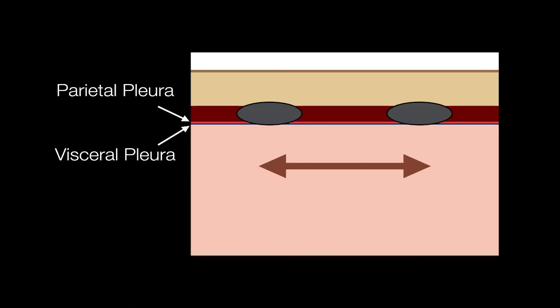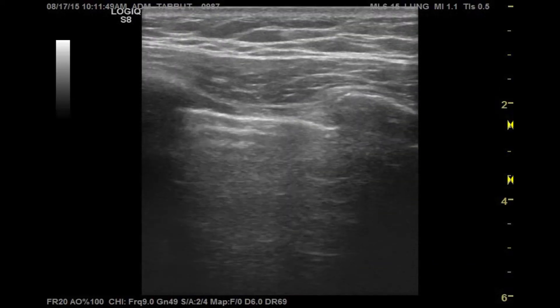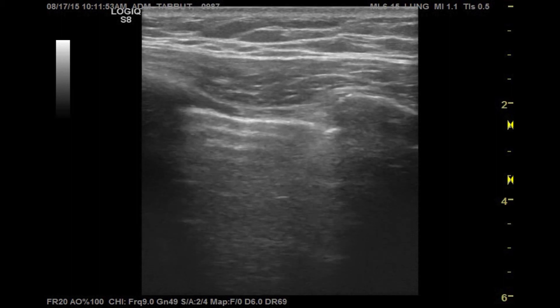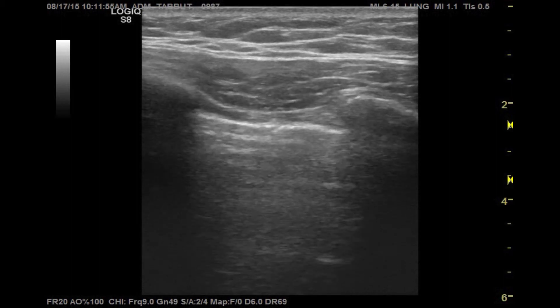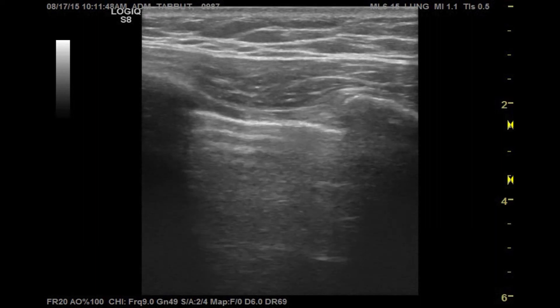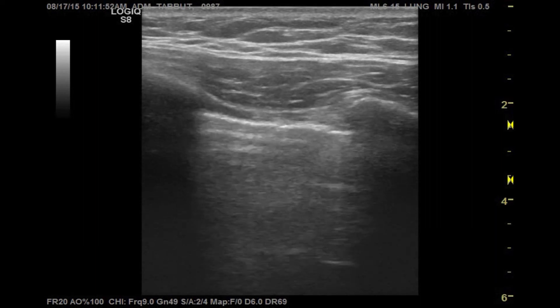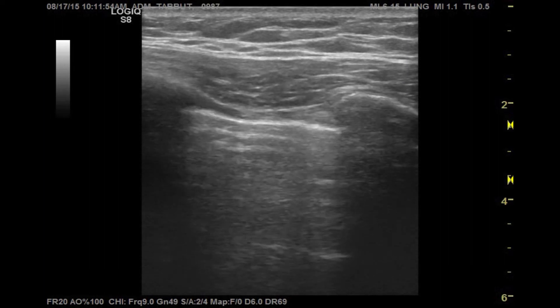As we breathe in and out, the lungs expand and contract, and the visceral and parietal pleura slip back and forth smoothly. This movement is visible on ultrasound as what we call lung sliding. In the normally breathing or vented patient, you should see movement along the pleural line — representing the visceral pleura moving against the parietal pleura. You can see the lung sliding — that pleura sliding back and forth underneath those ribs.